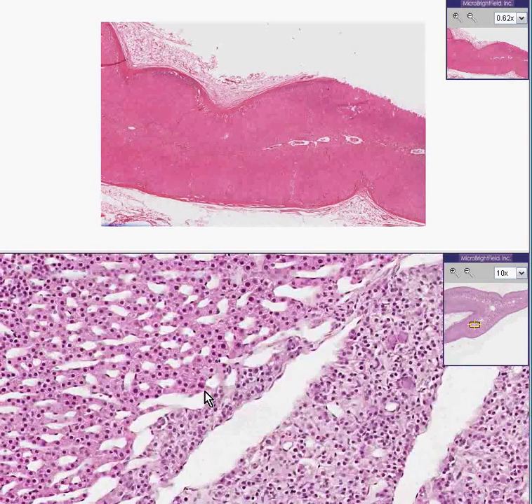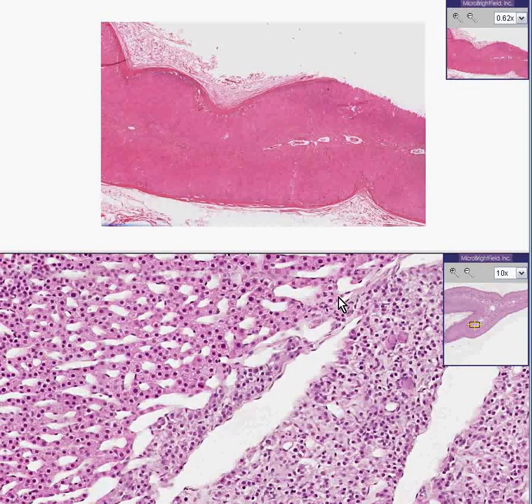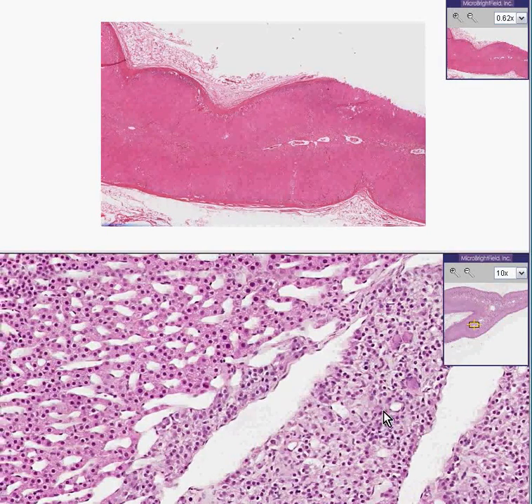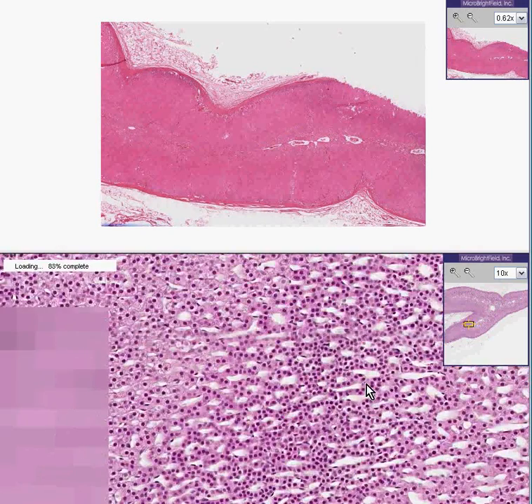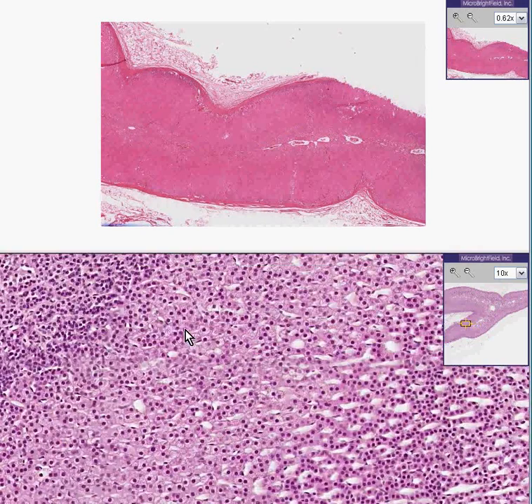This is a normal medulla. There is good demarcation between cortex and medulla and good delineation of the three cortical layers.